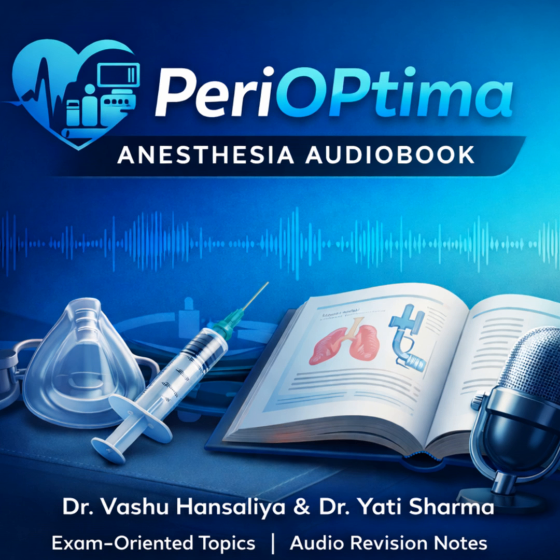So, if the GDC made SGADs safer by managing passive regurgitation, what additional design feature, a truly revolutionary barrier, would be required to make an SGA the safest choice for every single patient, regardless of their aspiration risk? Consider what it would take to achieve that definitive airway protection without tracheal invasion. That line of questioning will deepen your clinical understanding of why innovation in this space continues to be so essential.